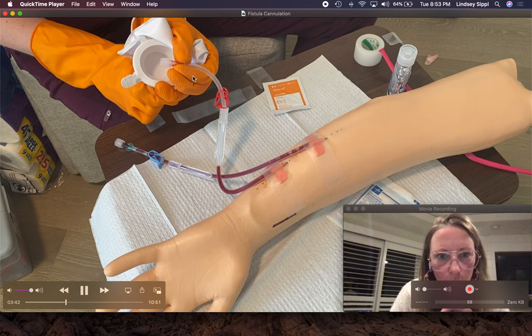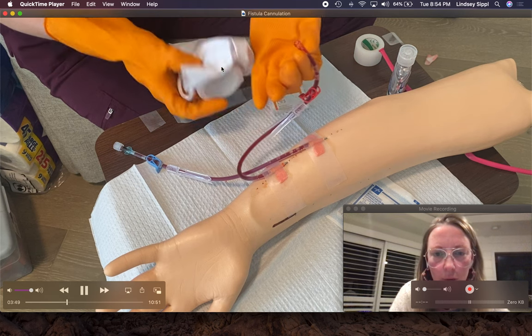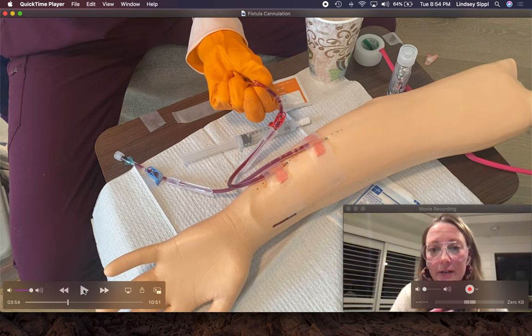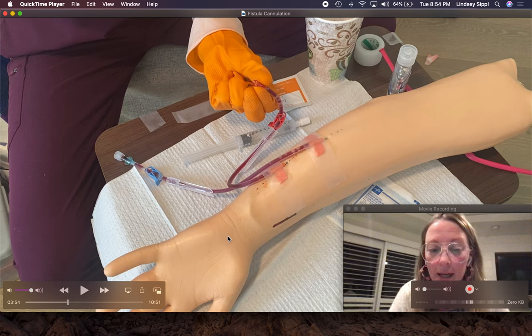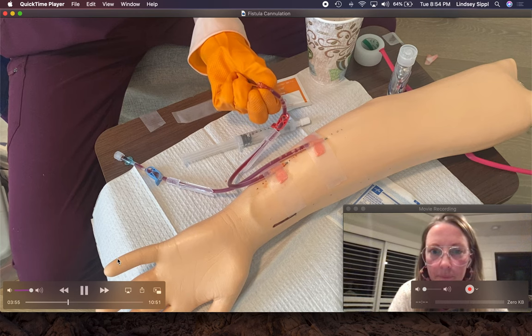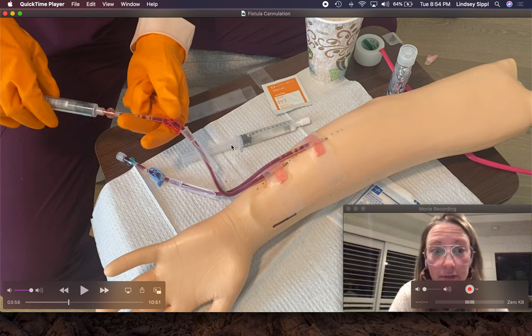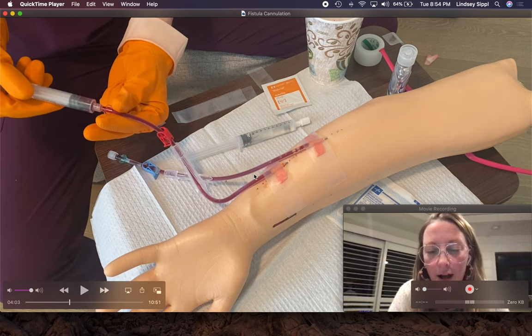I cannot stress this enough: you do not want to push anything back into this arm if you are not certain that the needles are in the fistula. If you're not certain, that means the blood's going to go outside of the fistula and you're going to cause pain, bruising, and damage. So I have an empty syringe and I'm going to pull back. If I'm not in the fistula, I will not be able to pull back. I'm getting a nice, easy blood return, so I can push that blood back in because I know I am in that fistula.